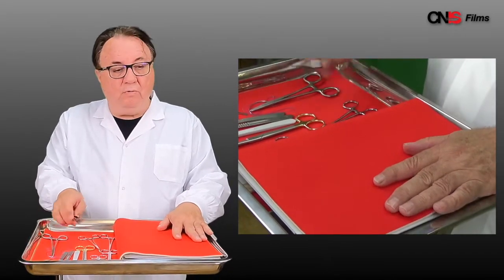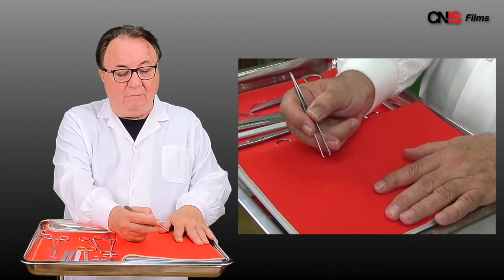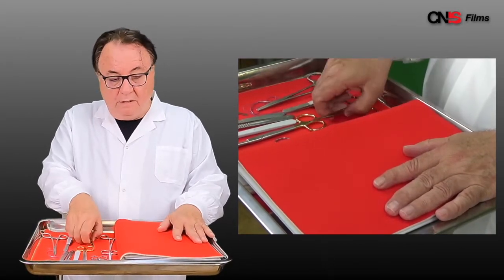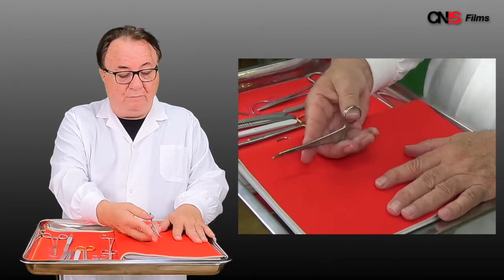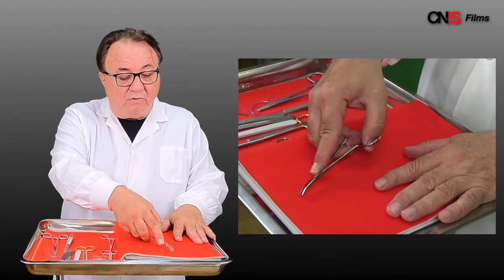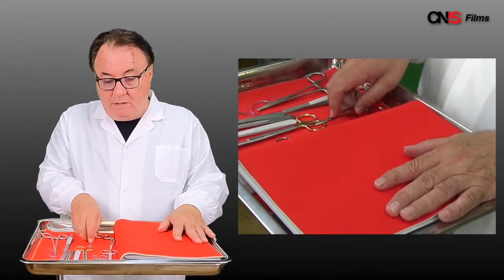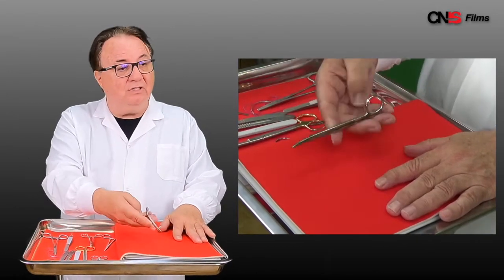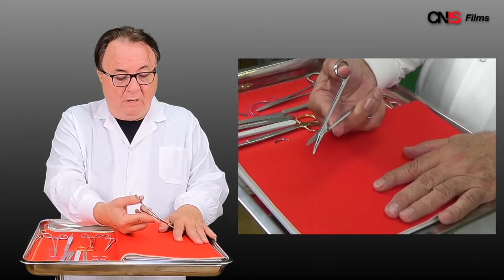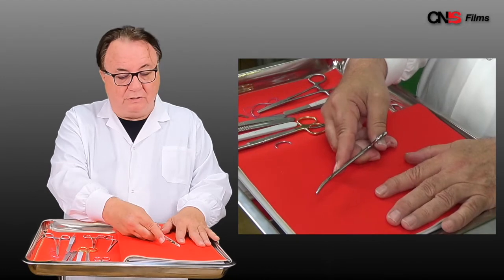It's true of the Adson forcep. My thumb, my index finger and my third finger control it. The artery forcep — fourth finger, thumb, index finger — so you grasp that vessel appropriately and skillfully. When you're dissecting with your Metzenbaum scissors, again thumb, fourth finger, index finger to make sure you know where the tip of that instrument is.